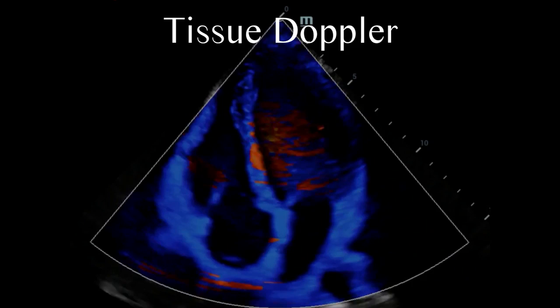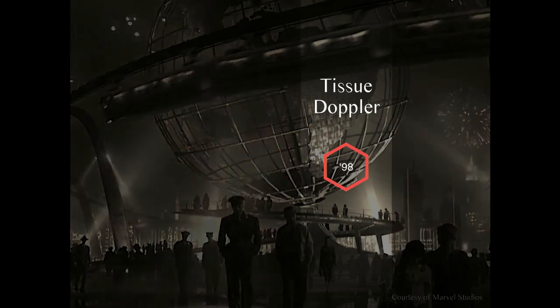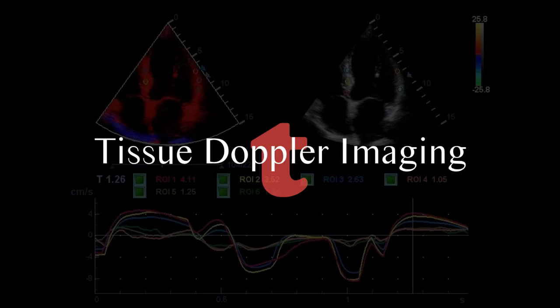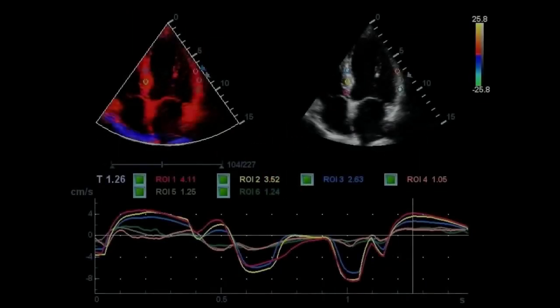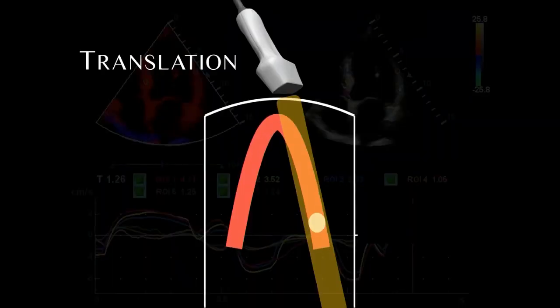And in doing so, we've gotten a small window into global and regional myocardial function. And this understanding led to the development of tissue Doppler. And it was an early step in the echo assessment of cardiac mechanics. And over time, the technique evolved, and we were able to use tissue Doppler imaging to essentially assess myocardial motion at one point relative to another. And our goal was simple. We wanted to analyze regional motion.